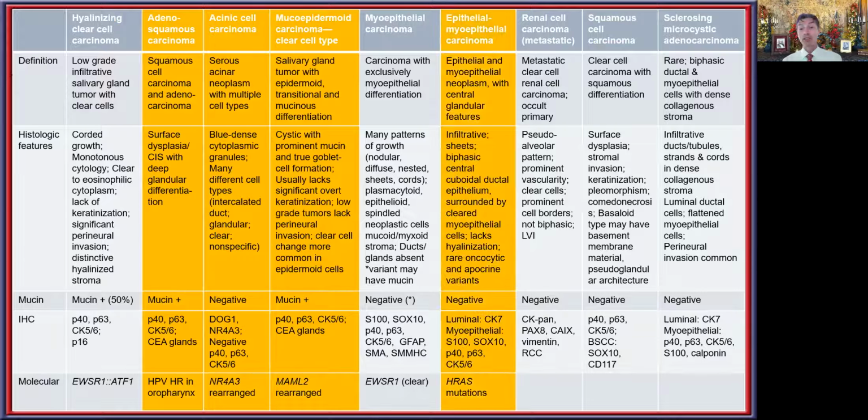So I already showed this as I drove the slide a few moments ago, but just again to reiterate, a very infiltrative nature to the tumor with a sclerous type appearance to it, and prominent perineural invasion. I think here you can see that there is a very well-developed nerve over here with multiple nerve twigs present, and each of the nerve twigs is surrounded by this very prominent clear cell neoplastic infiltrate.